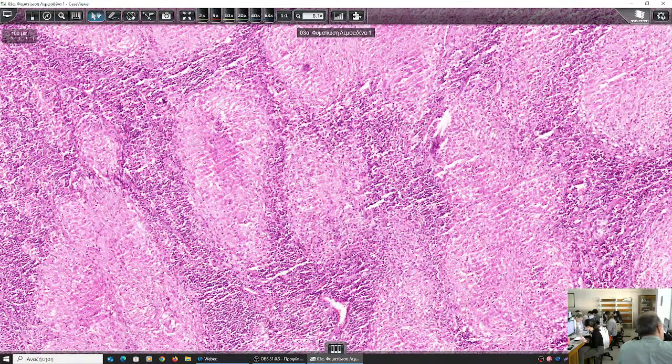Remember how caseous necrosis looked? It was some part where the tissue was of no shape. So can you show me? Yes, come please, sit here and show me, please. Okay. Which one, the right or the left? The left. Here is the left.